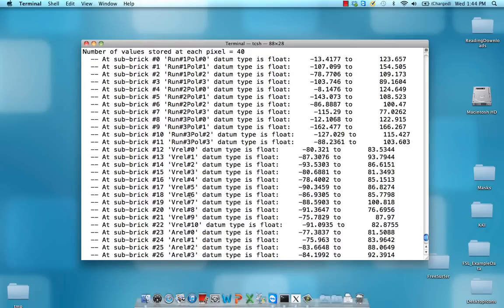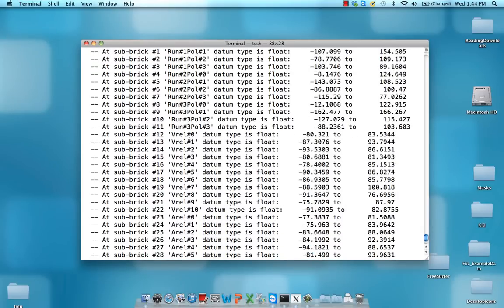These are all the coefficients for everything—the polynomials—and notice here for the visual condition I have 11 time points, just like I specified in my model.